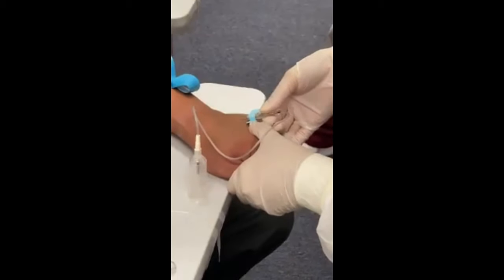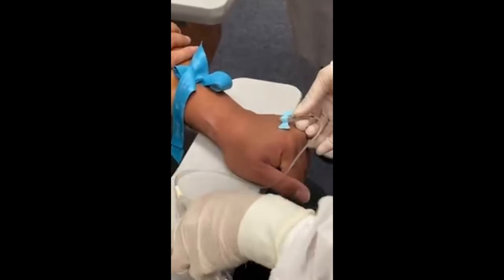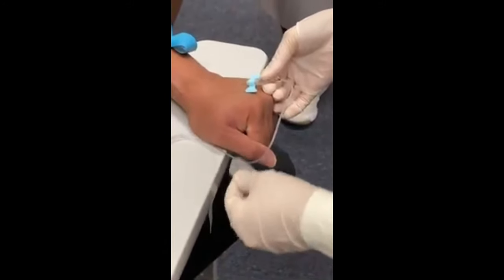Where did it go? No, you're good. Oh, there you got it. Perfect. I see the flash. So for this one, you can actually let go. Yeah, you can let go. I put two tapes here. Yeah, there you go. Perfect.